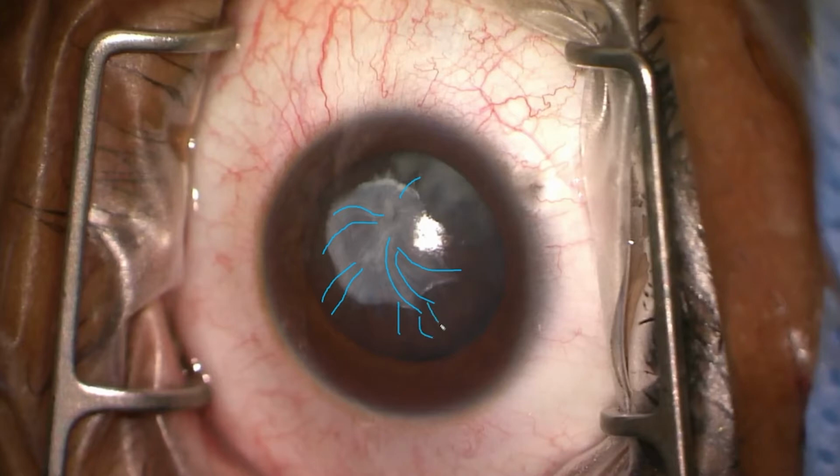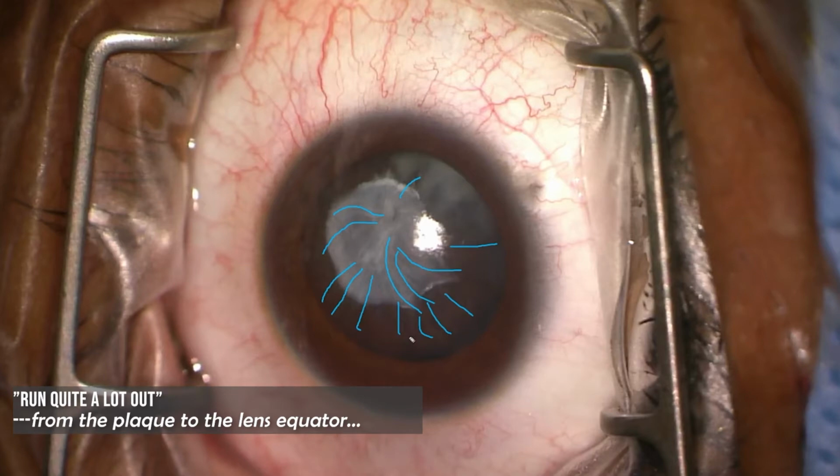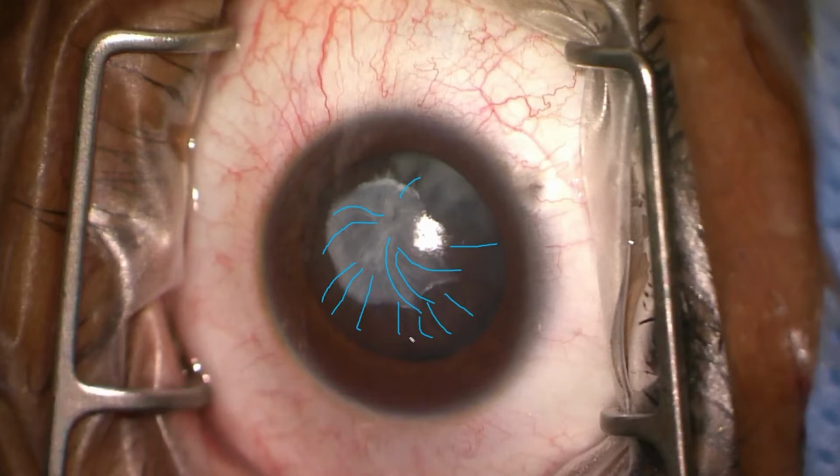But you see these radial lines. I think they're more stress lines or wrinkles that are in the anterior capsule, and they run quite a lot out. What that makes me wonder about is whether the capsule itself is quite fibrotic and is not going to tear even if we can make an easy hole in it. So there's another thing that stood out to me, and I don't know whether you've seen it yet, but it's this shadow that we see right over here.